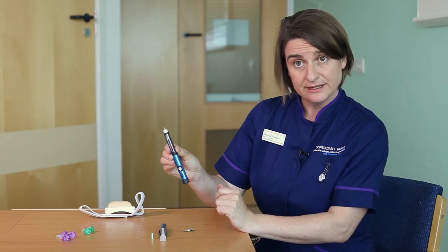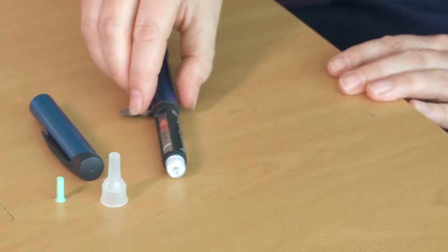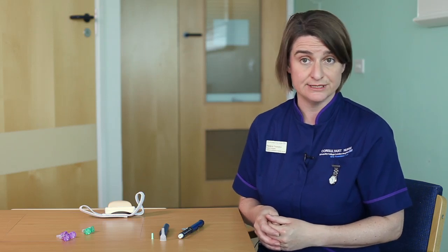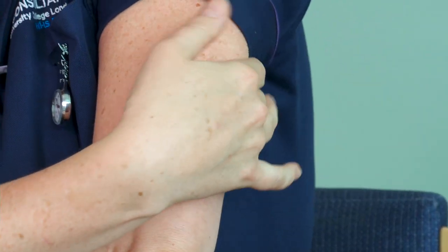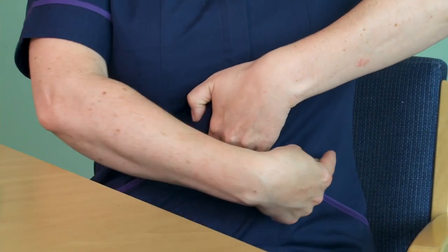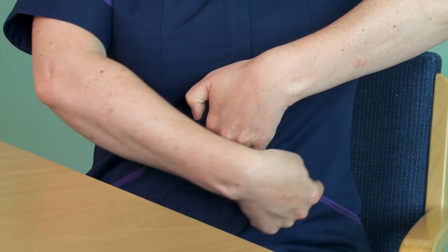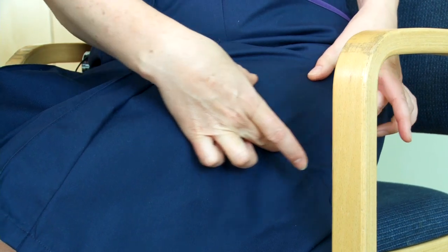Having done that you're now ready to give the injection. Places that you can do your insulin injection will depend on the age of the child and their own preference, but sites include the arm around the back of the arm, the tummy — if you imagine your belly button, a happy smiley face around the belly button is where you can do the injection — the legs on the outer aspect of the thighs, and the buttocks. Each child will have a preference as to where they have their injection.